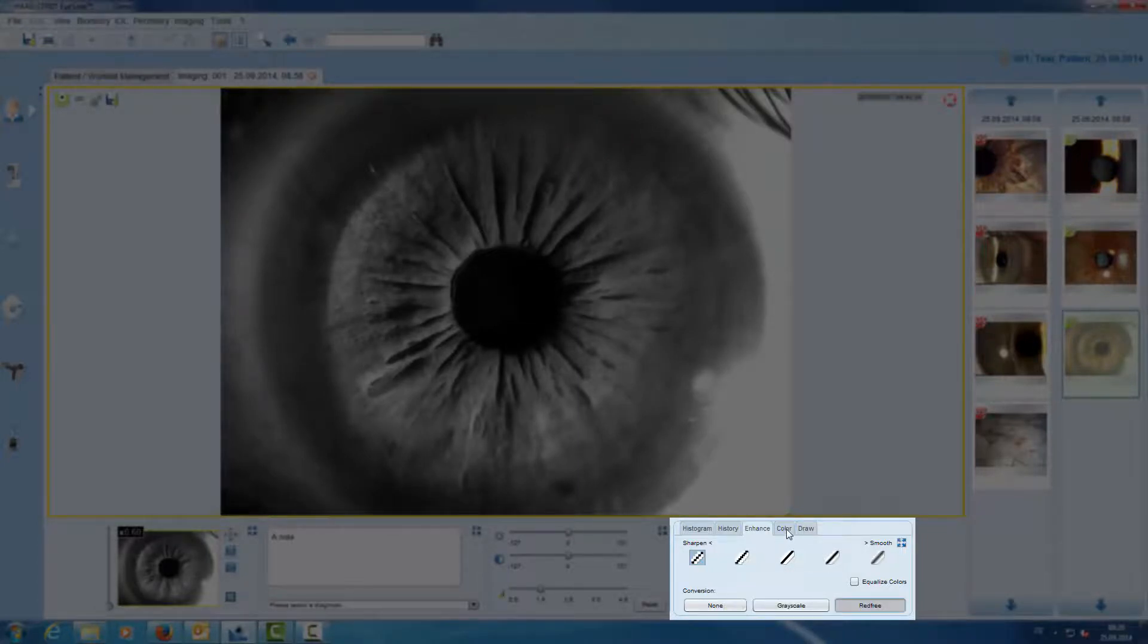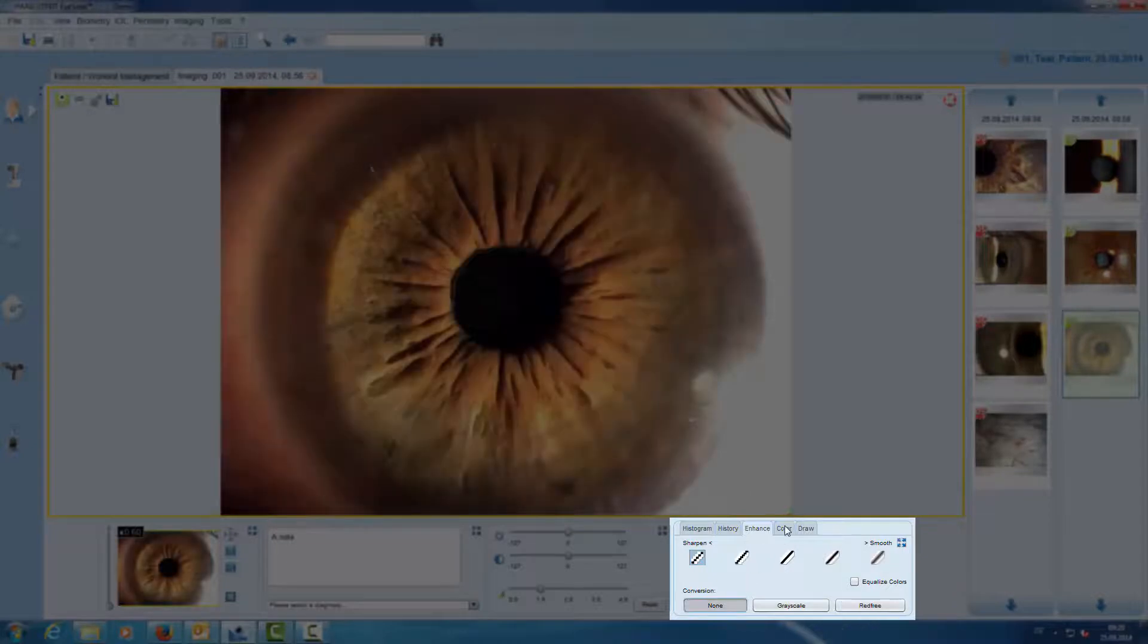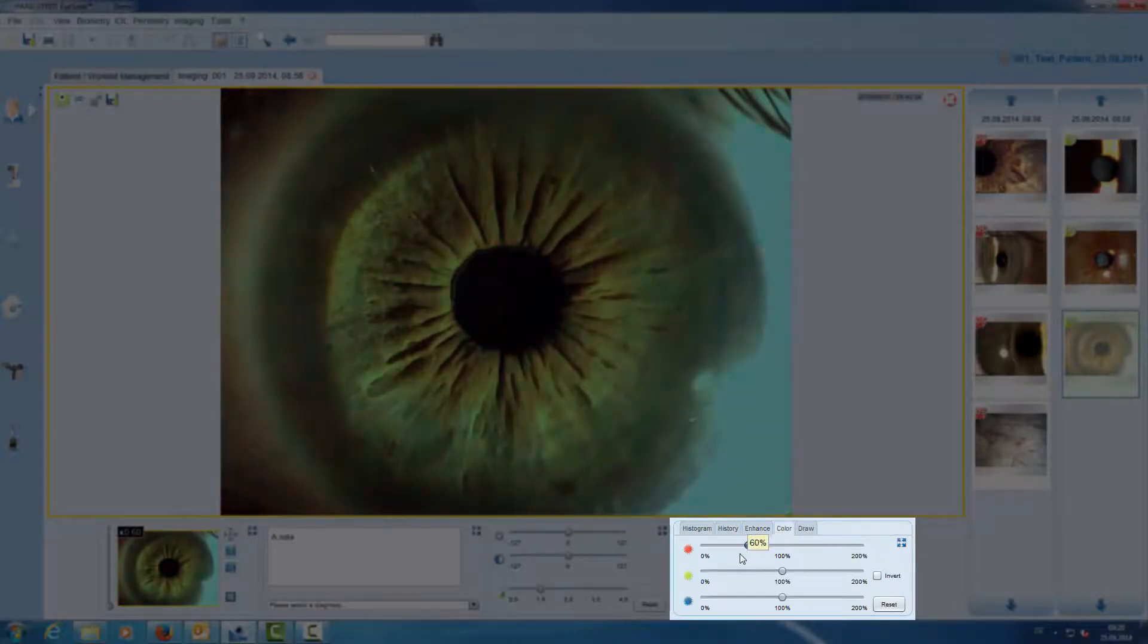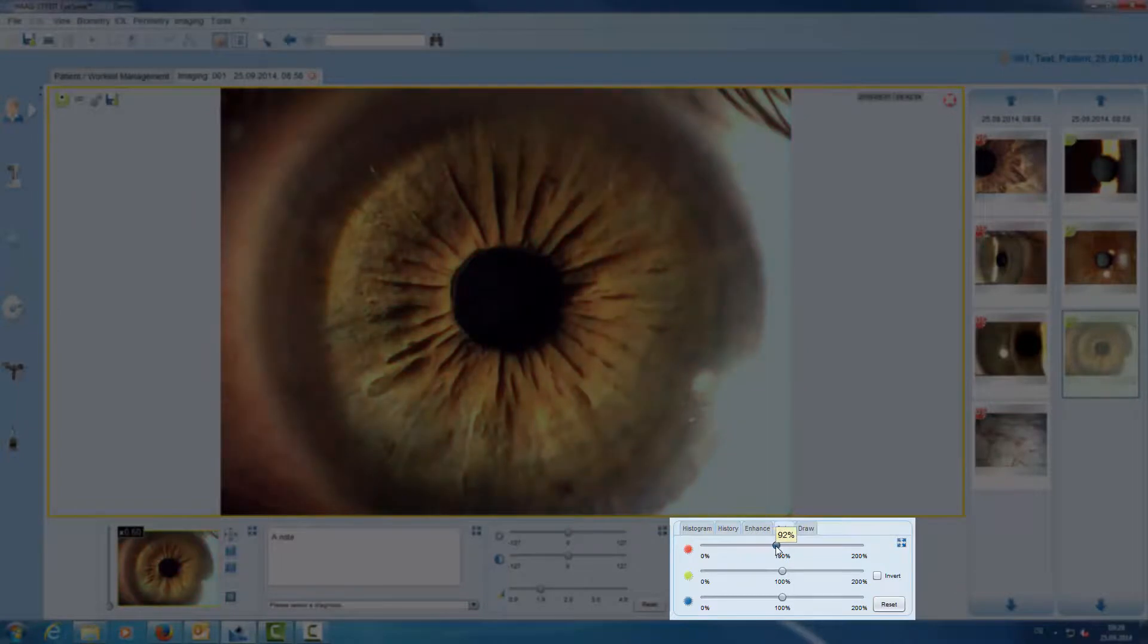The color tool gives us the possibility to adjust different color channels.